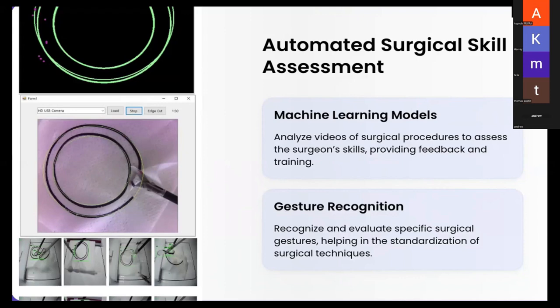Here I am using color filtering in computer vision to track the scissor tips and tell the surgeon where he was cutting through the training, and give him a detailed report at every instance, at every third part of the second, where he was, and give him an assessment based on fuzzy logic. Also, I used YOLO version 7 to track the surgeon's tips and tell him, using object detection with bounding boxes, the exact position now, and give him near real-time tracking through the training.